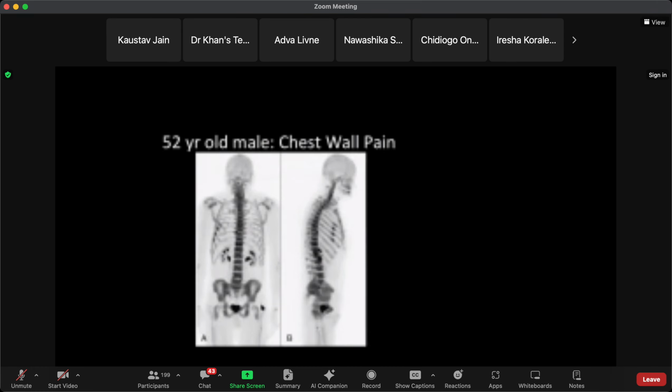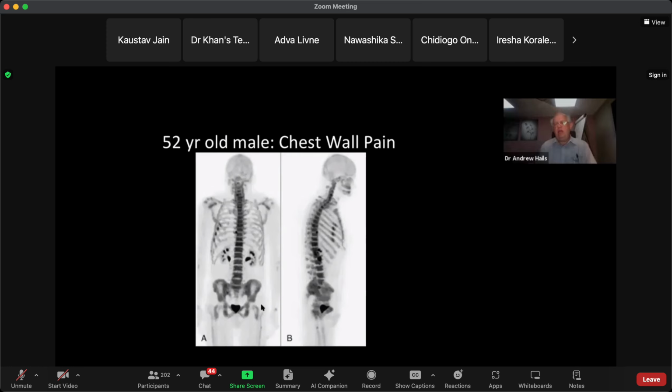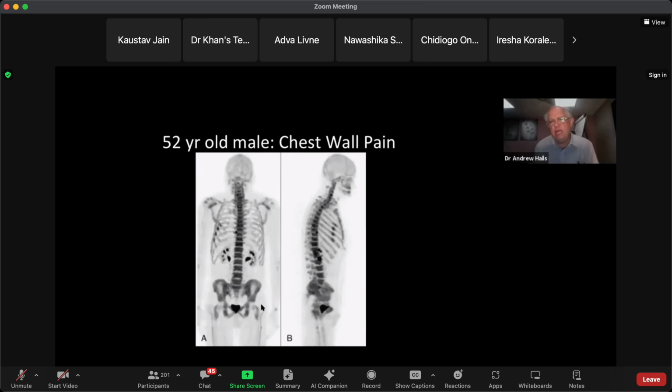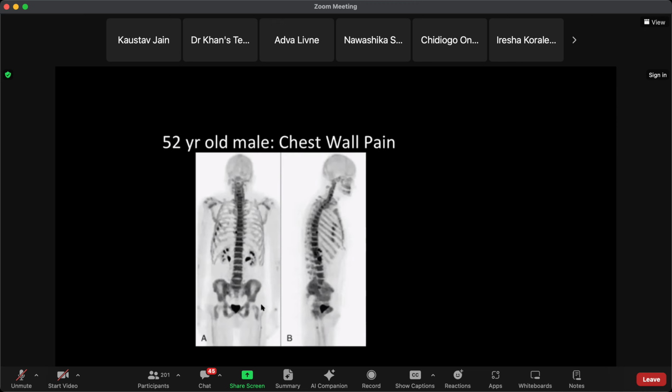It looks almost like it's at the end of the rib. So whether they've got a costochondritis, or is it not far enough anterior? I think probably not far enough anterior, but more particularly, if you get uptake in contiguous ribs like that, it really is always due to trauma. And it doesn't have to be the most severe trauma.